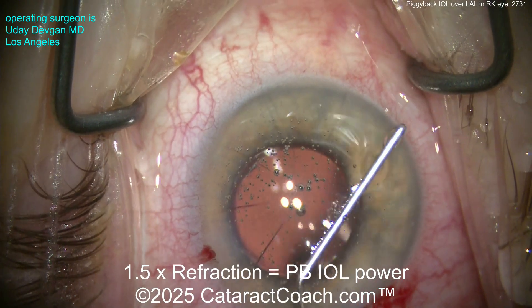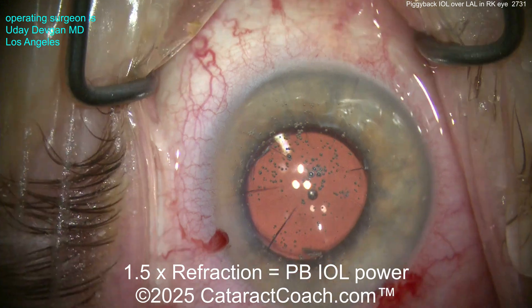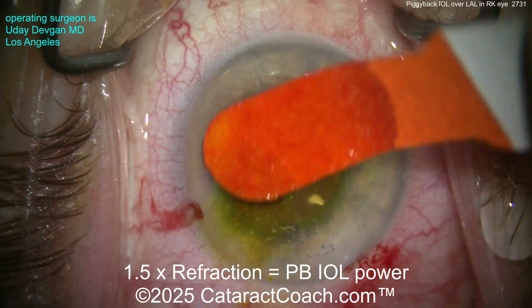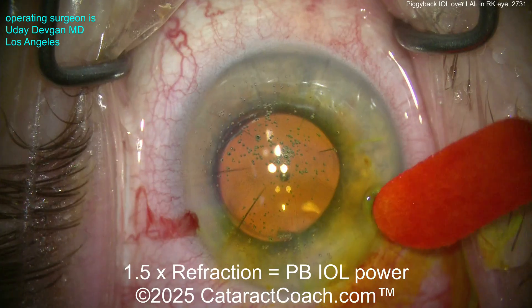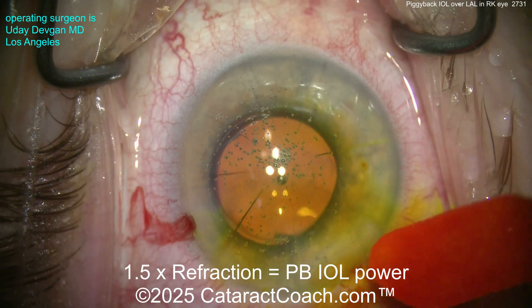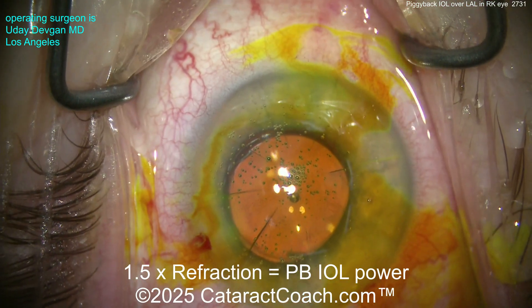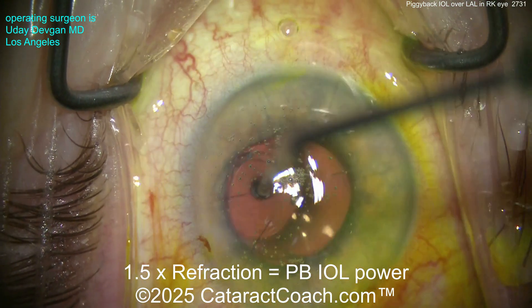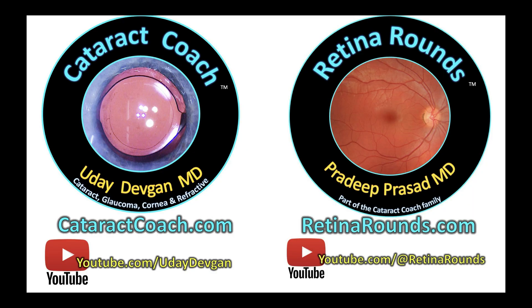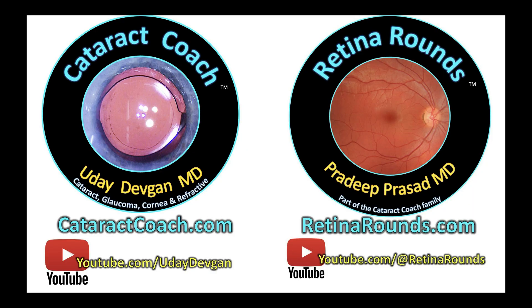Key takeaway: RK patients need time to go back to baseline. Make sure the post-op K value has returned to the pre-op K level before making a decision about the refractive state of the eye. Here fluorescein dye is used to make sure everything is sealed up nicely. Check out retinarounds.com, our sister channel, and cataractcoach.com for more information.